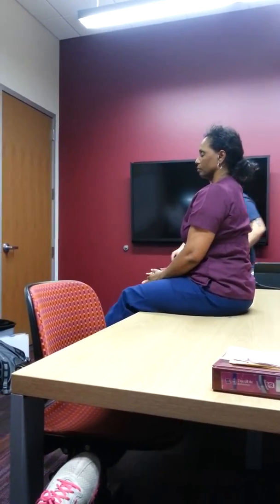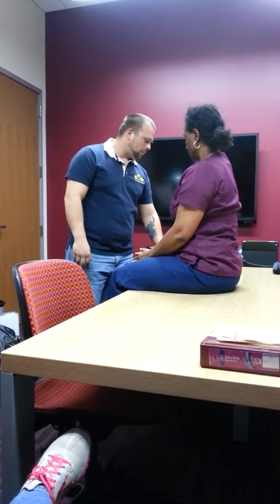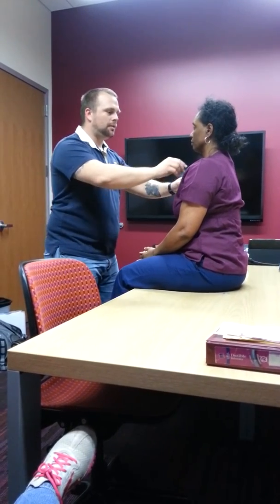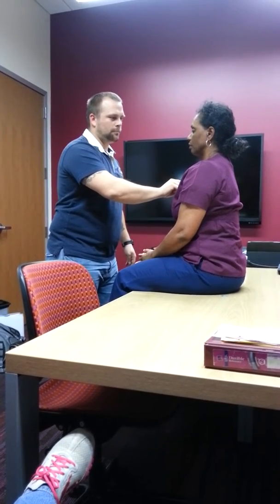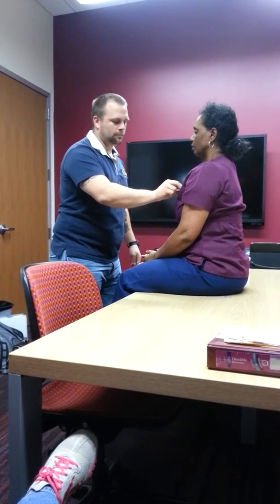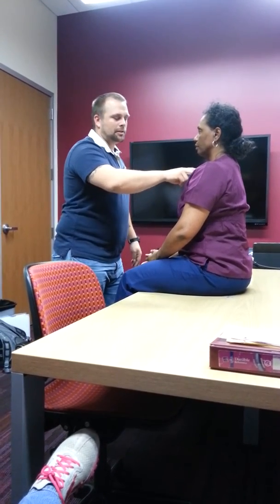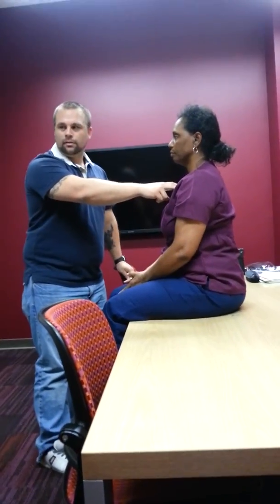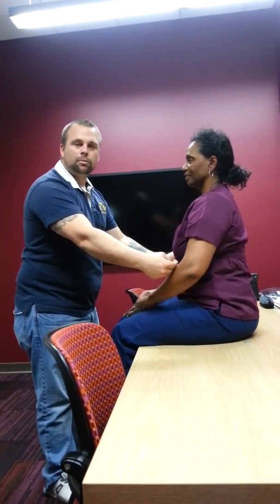All right. So I've done that. Also, I'm going to listen to the front, to the sides. Here I'm listening to vesicular, bronchovesicular, and bronchial lung sounds.